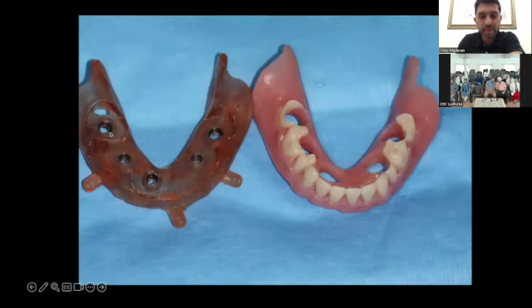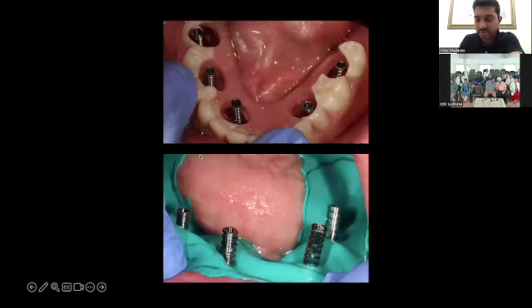So if you see the implant planning, and this is the implant placement guide to where your actual implants are located, it's very similar, correct? So that means you've already planned everything ahead of time before you went into the surgery. And then this is the traditional way of picking it up. These days you can do a lot of digital ways of picking it up, but all these techniques work. Digital is only one other way of doing it, but the principles remain the same, correct?